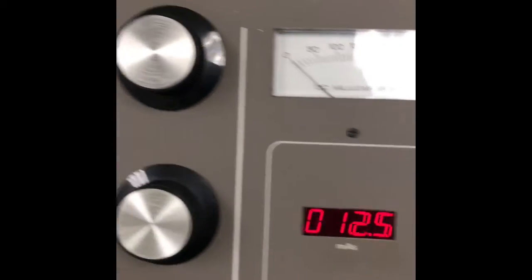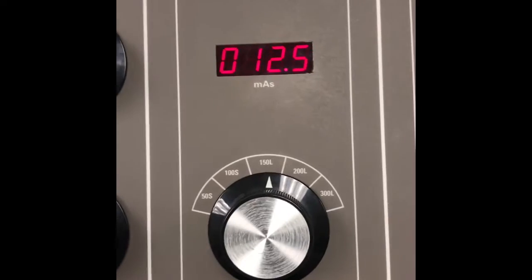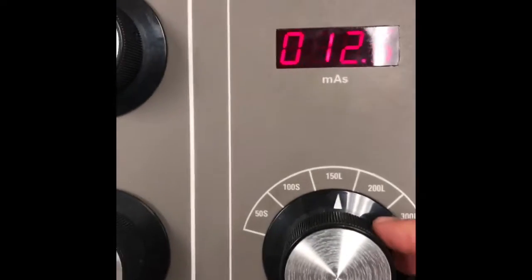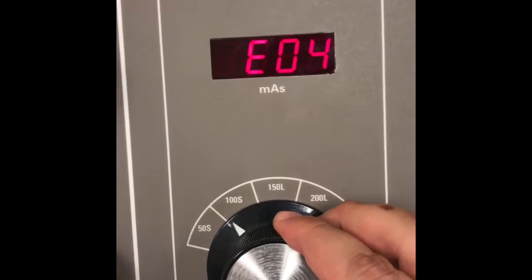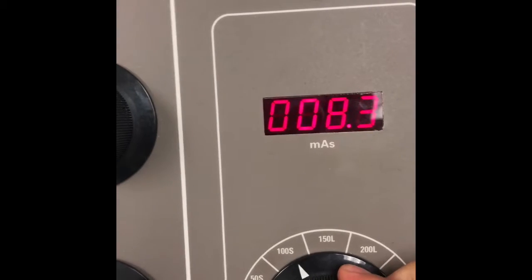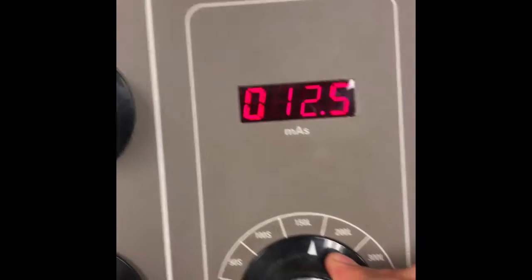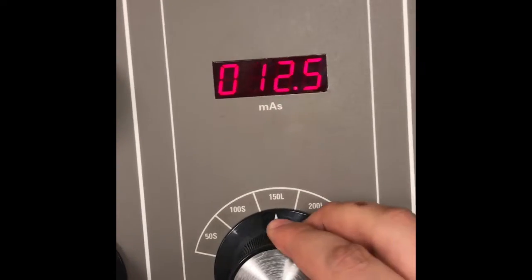Also, on the operating console is your mA selector, which the lowest is 50 and your largest is 300. And this is what's going to be supplied to the filament.